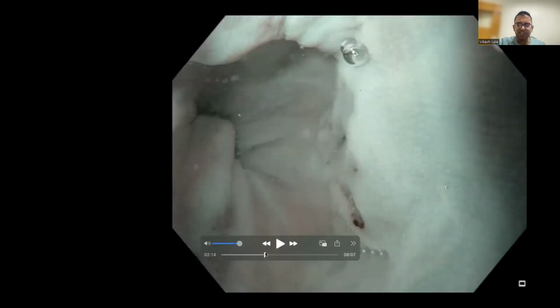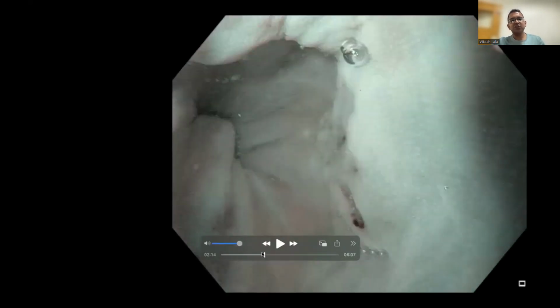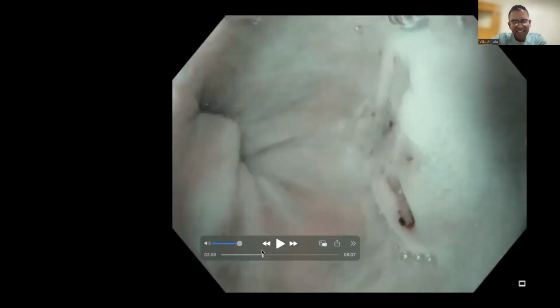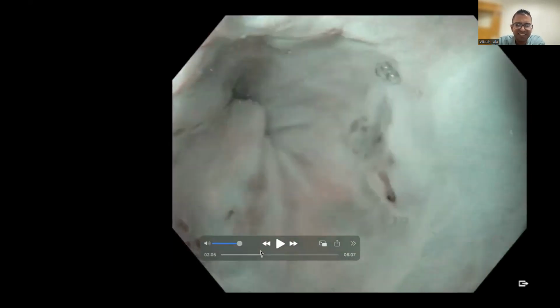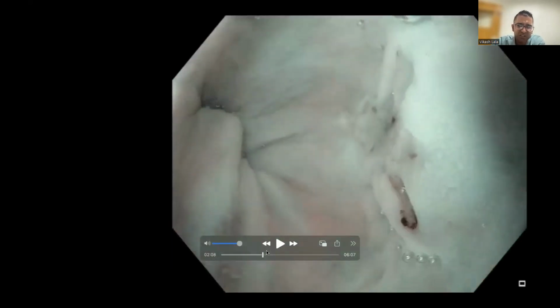So I proceeded to examine what I could. Now, this is very difficult because now you have neosquamous epithelialization, and you can't really assess the pattern of the rest of the esophagus. So this becomes a bit of a guessing game. So I assessed what I could. And these are some islands I'll show you now opposite that nodule.